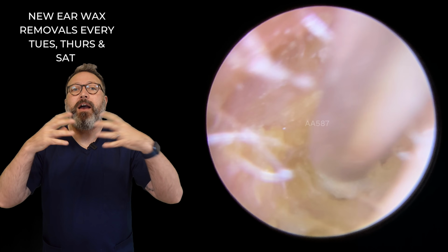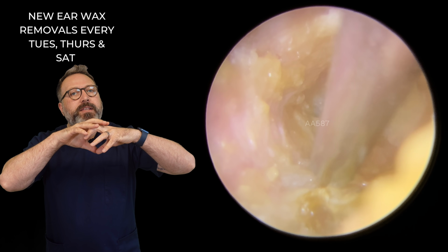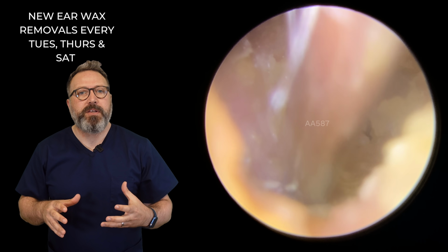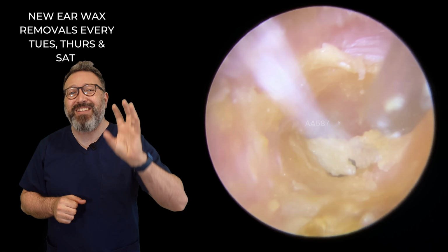Basically, what's happened is behind this foreign body, see, I didn't tell you, is basically the skin hasn't been able to migrate down the ear canal particularly well. So what we've ended up with is loads of really dry, dead skin trapped behind this.